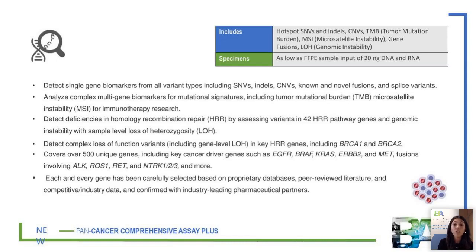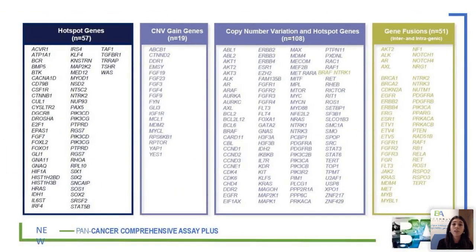We explore mutations in the EGFR receptor, but also mutations in BRAF, KRAS or HER2 genes, which have been proven to be really relevant for different types of cancers. And also, as I said, we are able to assay fusions such as ALK or ROS fusions, which are really important for treatment selection in different types of cancers. I'm not going to go into a lot of detail here.